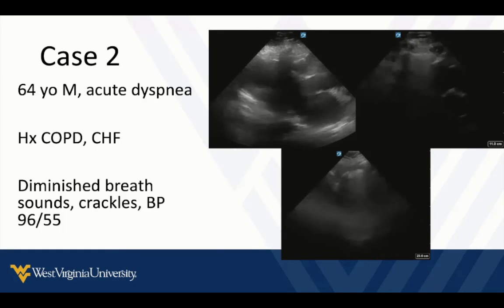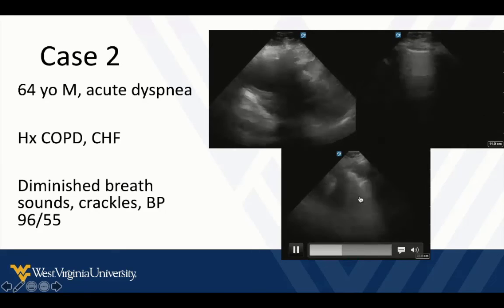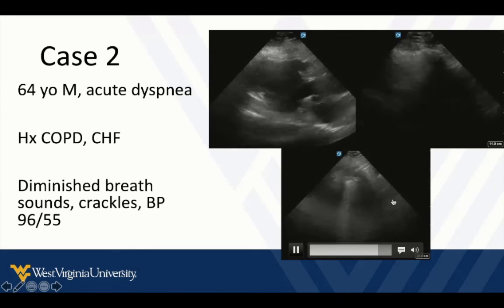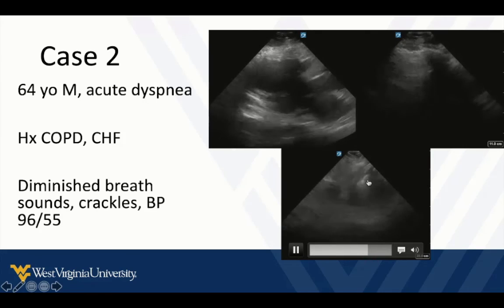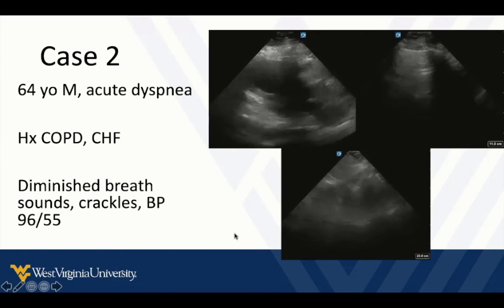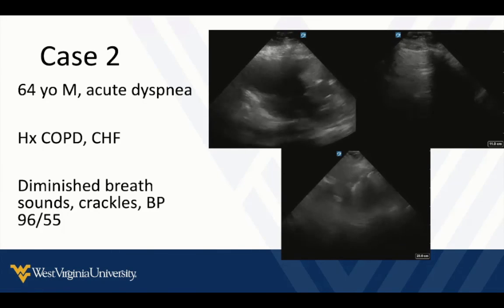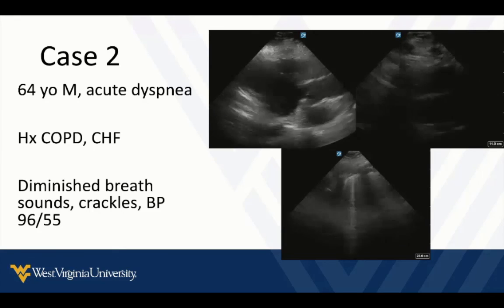be harmful to this patient, because what they've got is pneumonia, where we see kind of this area of normal lung, then we see a focal area of lots of B lines, irregular, ratty looking, gnarly pleura, and we actually see reasonable cardiac function. Of course, we do some other views, so that can help us tailor the therapy, give the patient the right therapy they need, and not cause unnecessary problems.